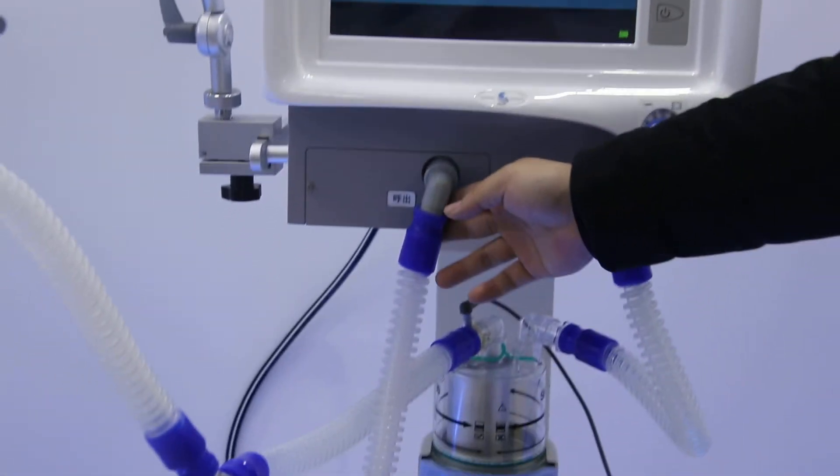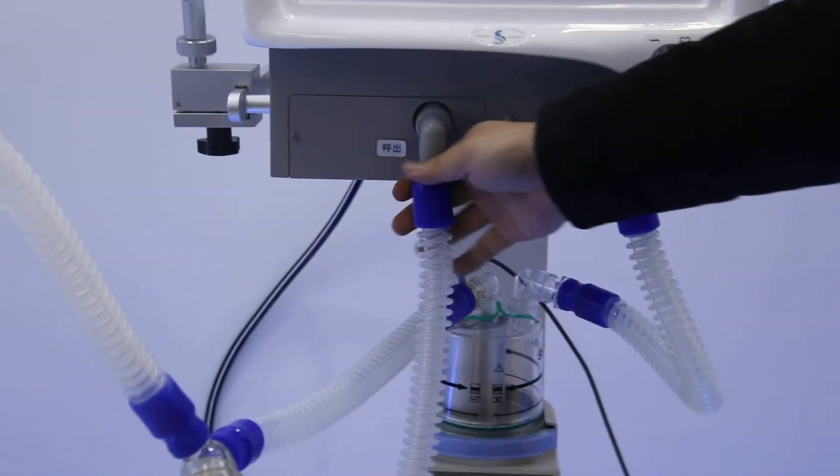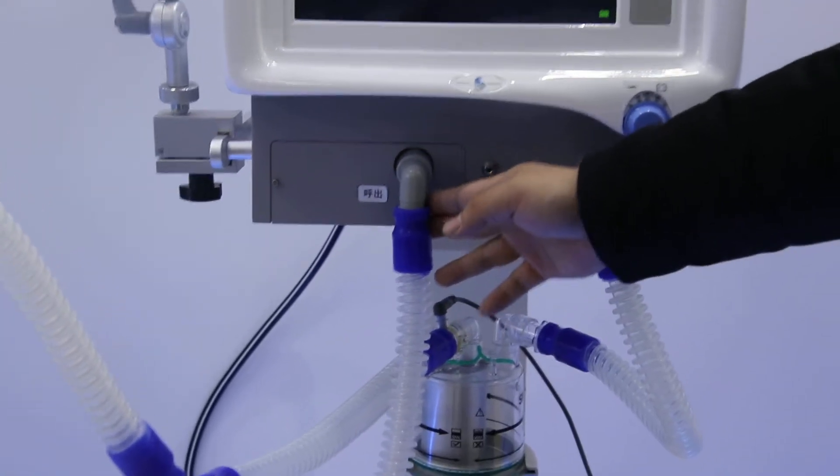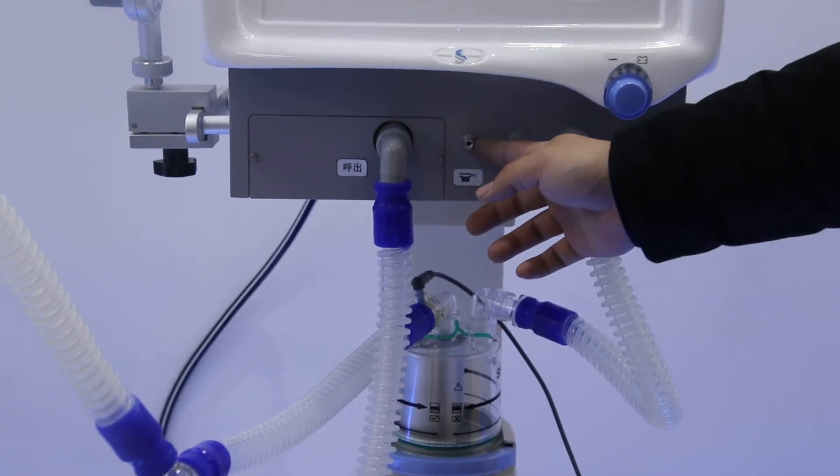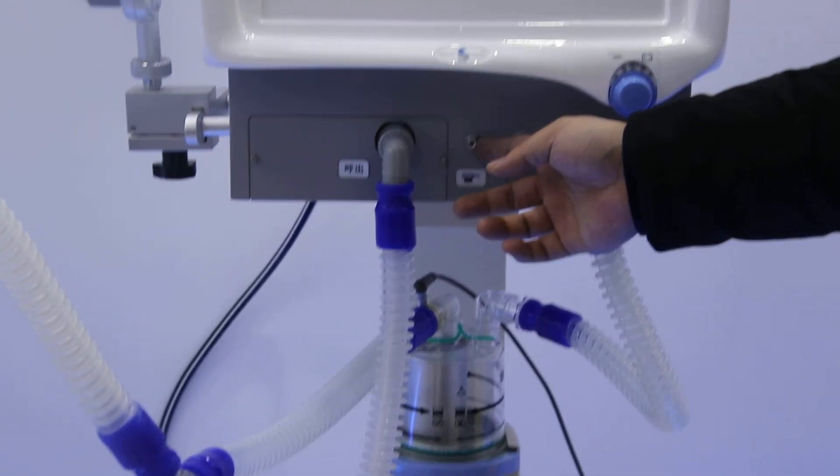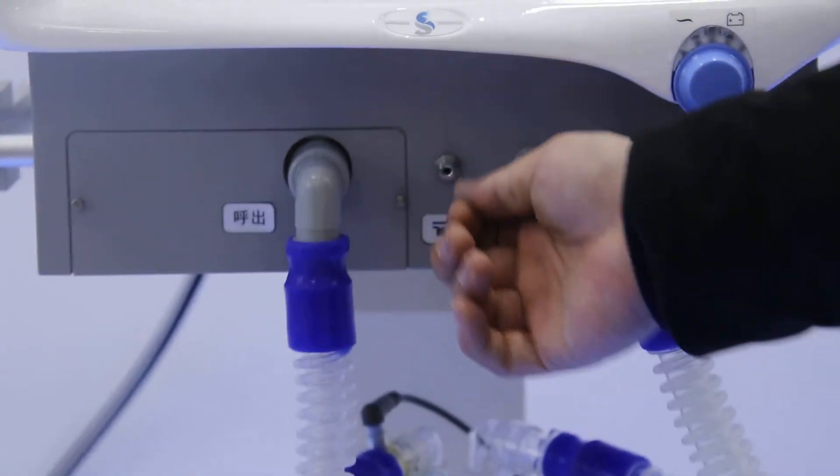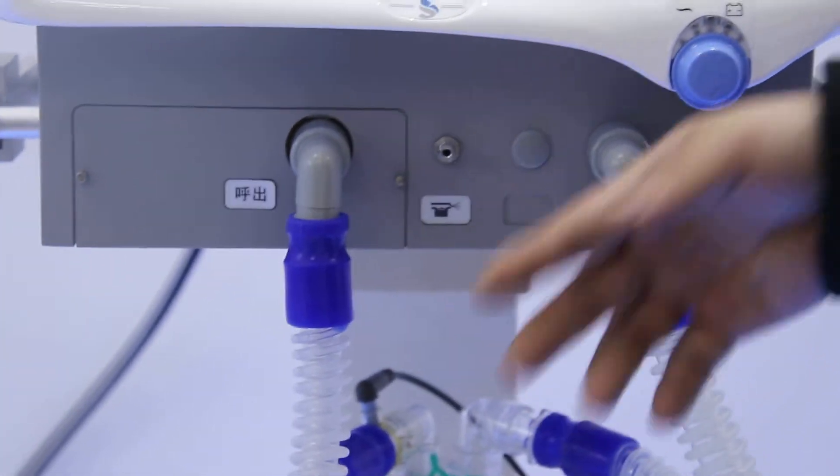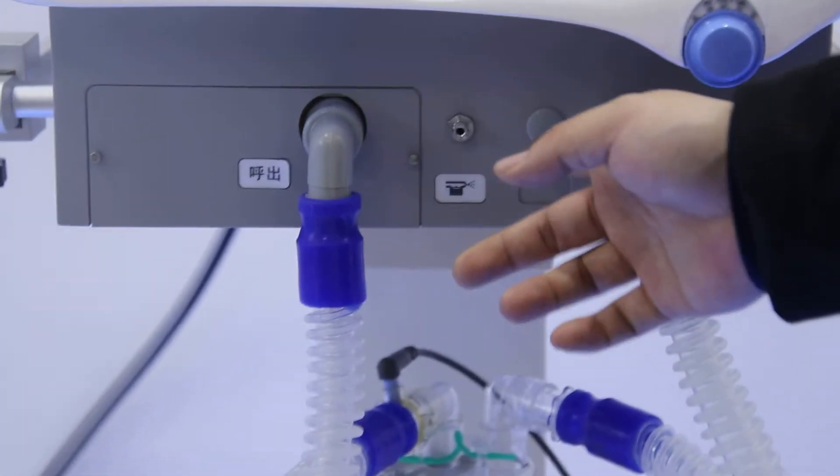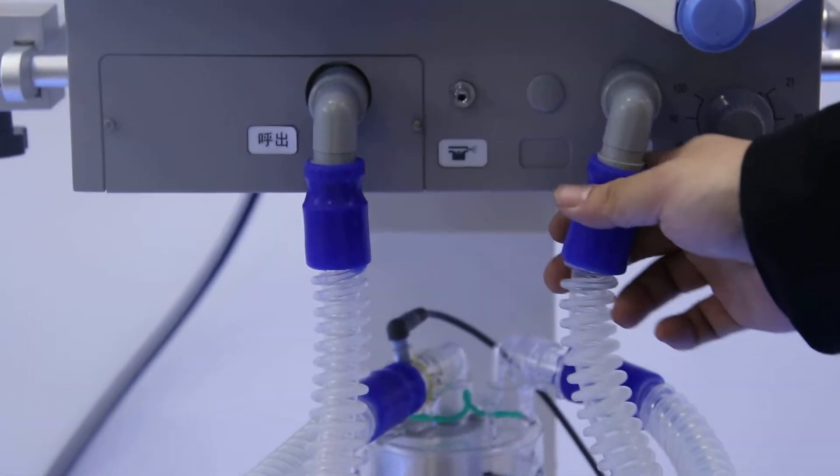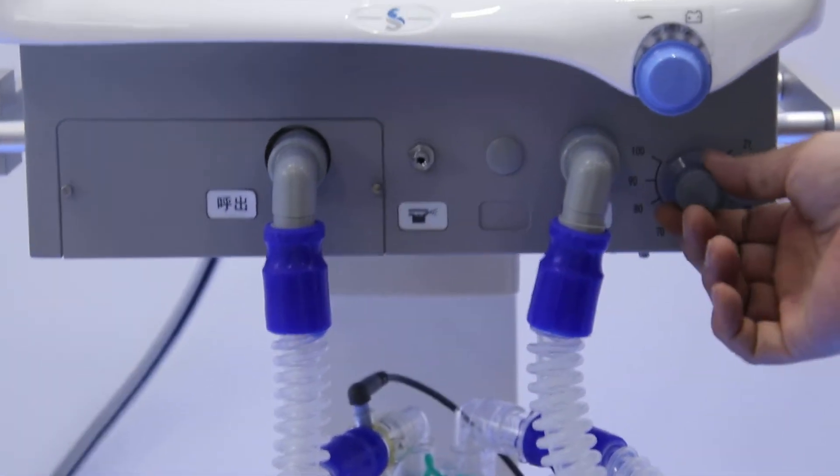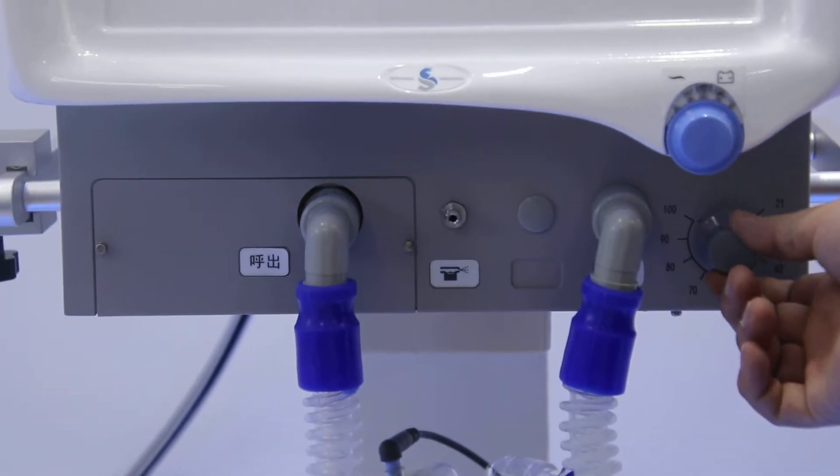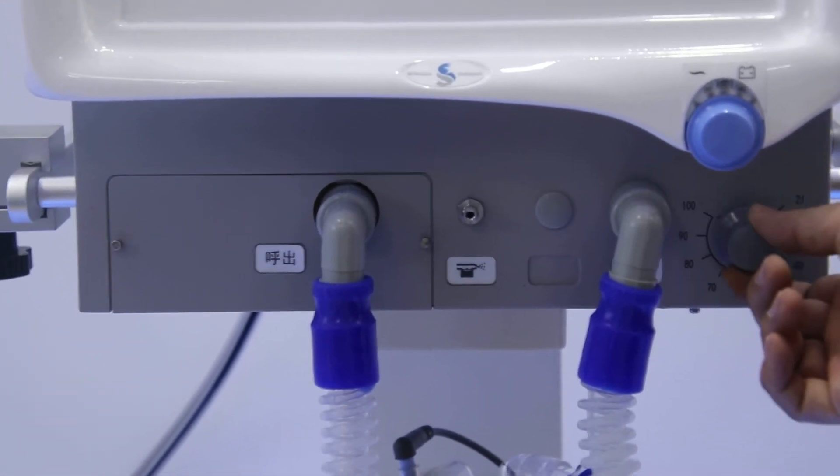And here you can see for this machine, we have totally four ports. The first one here is the expiration port. And this one is for the nebulizer. Once we need to use this function, we need to connect with a small pipe. And this one is for reserve. Later if the customer needs the ETCO2, then we will make this port. And the fourth part here is for the inspiration port. And this rotary button is for changing and adjusting the oxygen concentration from 21% to 100%.